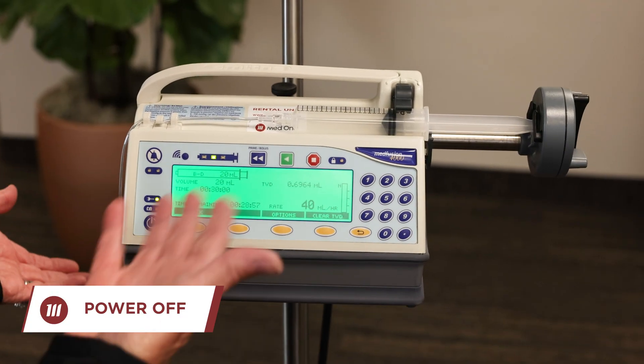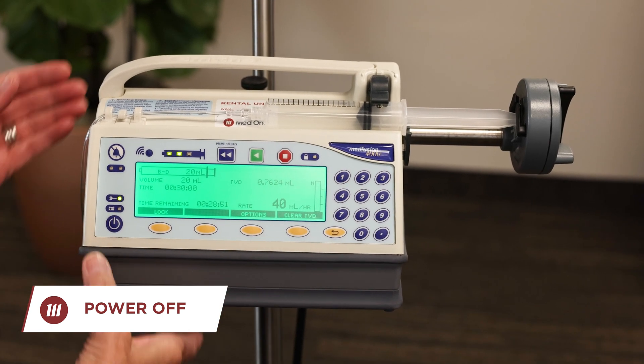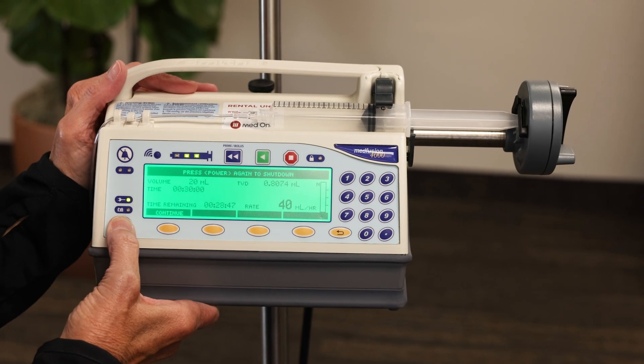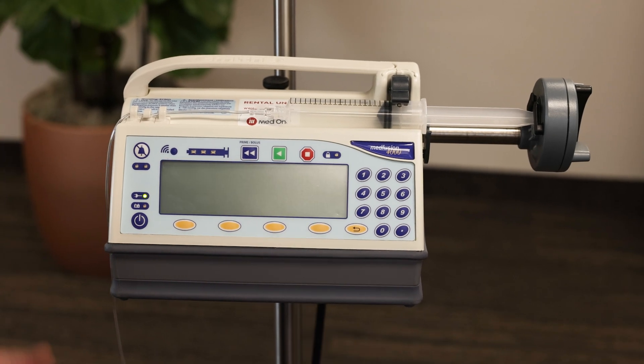Now I'll show you how to turn the device off. Assuming the device has gone to syringe empty and you're ready to shut it down, press and hold the power button. It will say 'press power again to shut down' — let go and the device powers off.